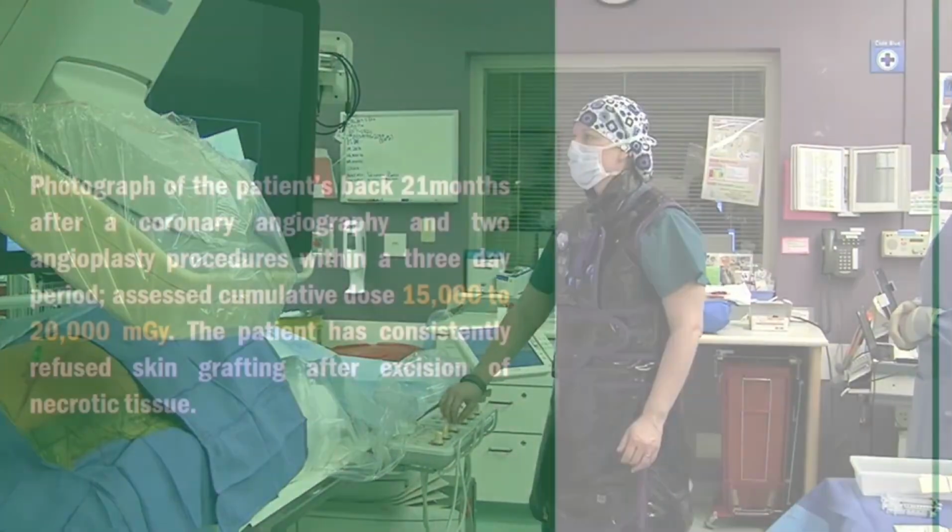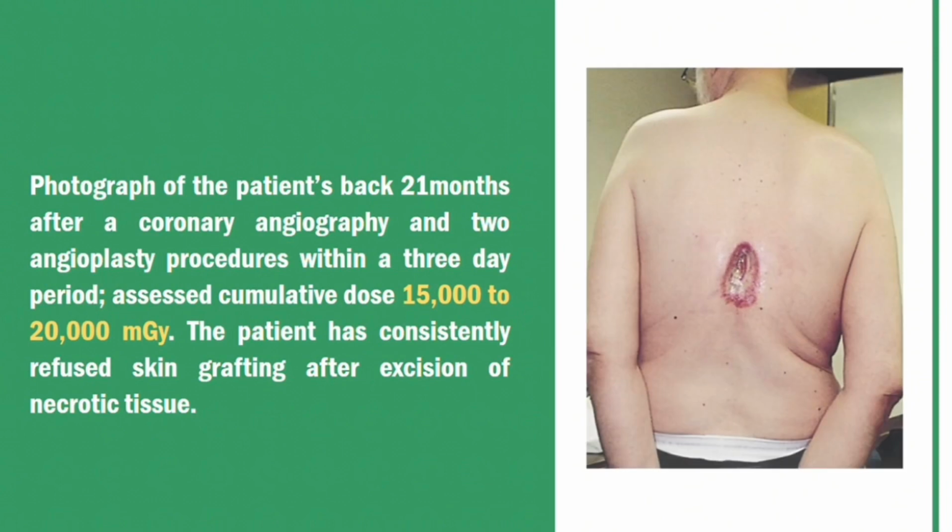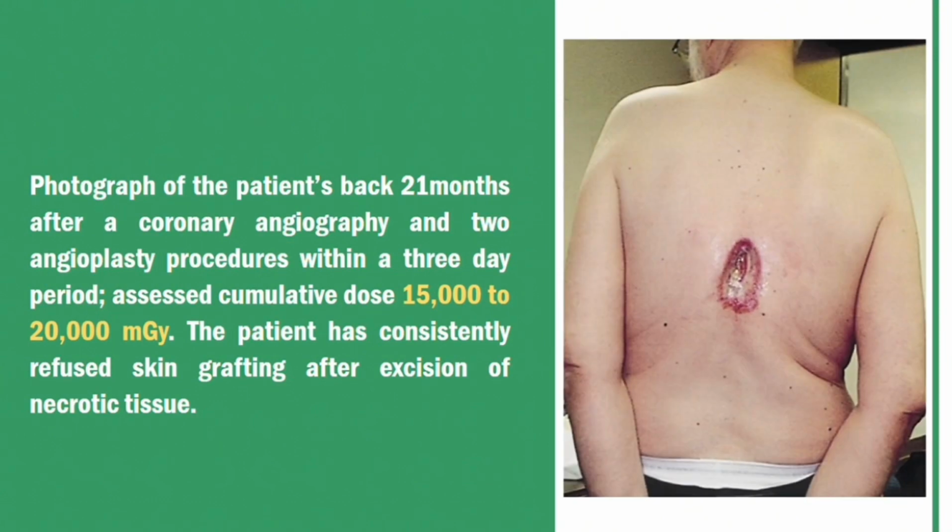So this is a photograph of the patient's back 21 months after a coronary angiography and 2 angioplasty procedures within a 3-day period. The assessed cumulative dose was 15,000 to 20,000 milligray. The patient has consistently refused skin grafting after excision of necrotic tissue.